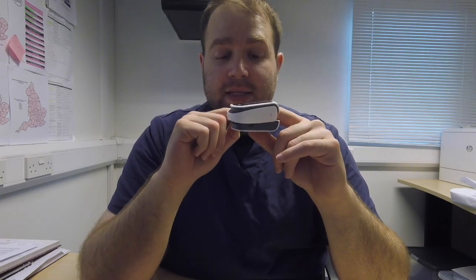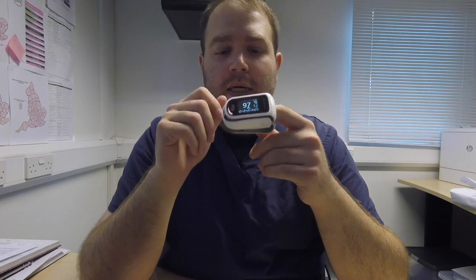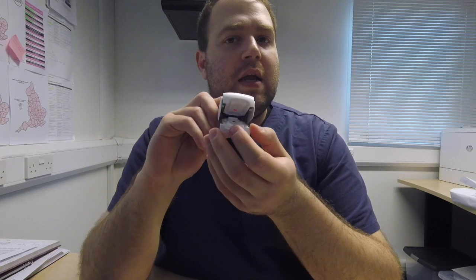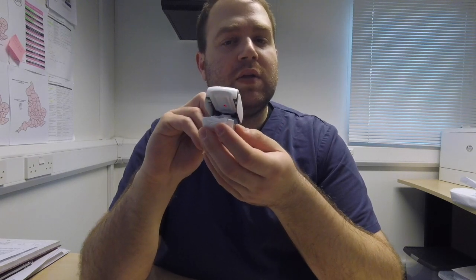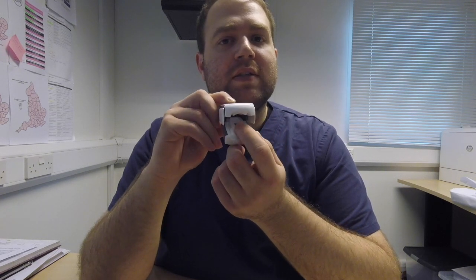Before I said it's not meant to be used in animals, and that's mainly because of the outer band, which may prevent use on bigger tongues. Also, the fact that the sensor sits quite far in may prevent use on very small tongues. Otherwise it's very quick to pick up measurements — very, very quick.